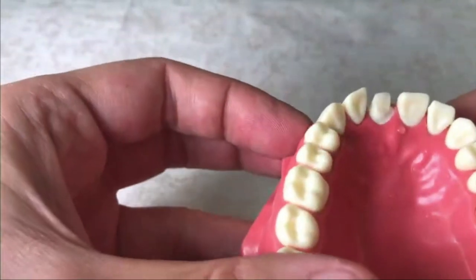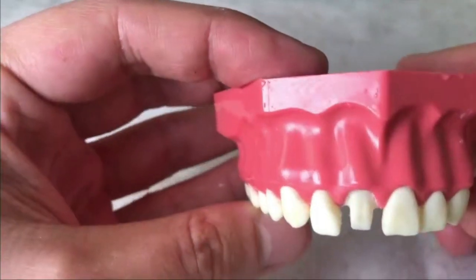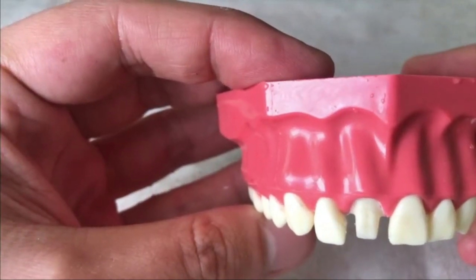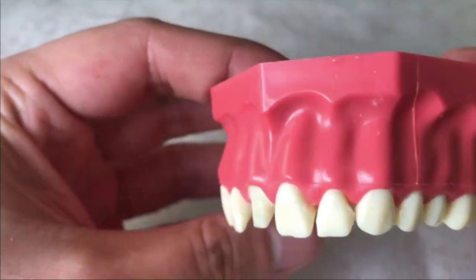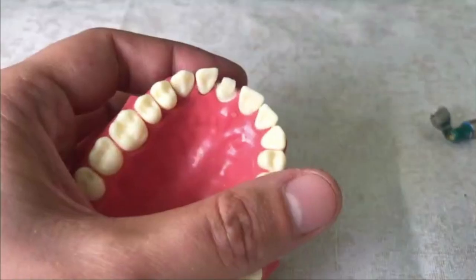Things that you should pay attention to are not leaving undercuts, the location and shape of the bevel, making the preparation as smooth as possible, avoiding damaging gum tissue and neighboring teeth during preparation, and avoiding leaving sharp corners.